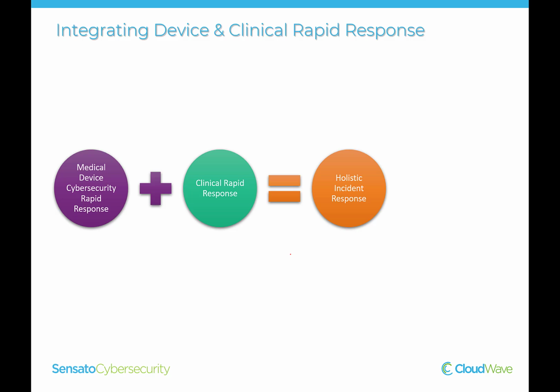You need to have a situation where, if somebody calls the help desk, they're going to be able to go, whoa, this looks like probably something impacting patient care, and we're going to dispatch the clinical rapid response team. And it's seamless, right? We don't want somebody having to call somebody else that's then going to dispatch the team. Time is of the essence. And this is what the rapid response team probably has protocols already in place for, right? They're already getting the call to go to the bedside when there's potentially a stroke or some other situation that is possibly impacting patient life, right?